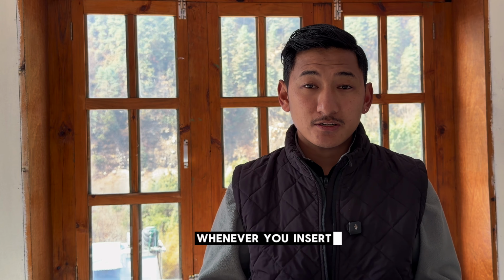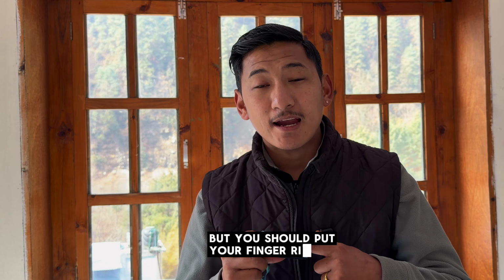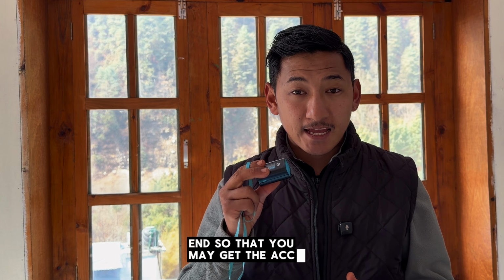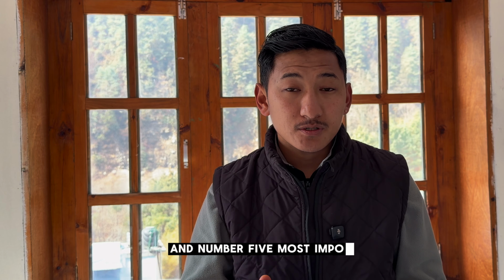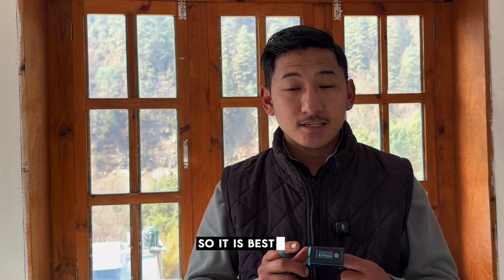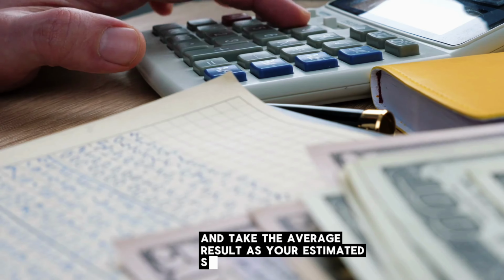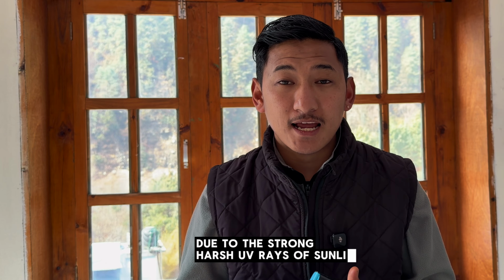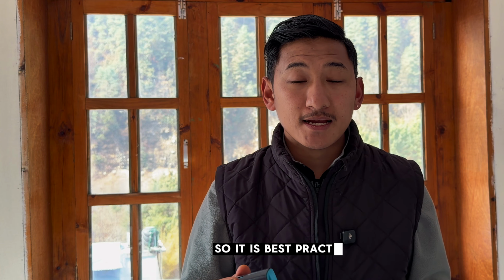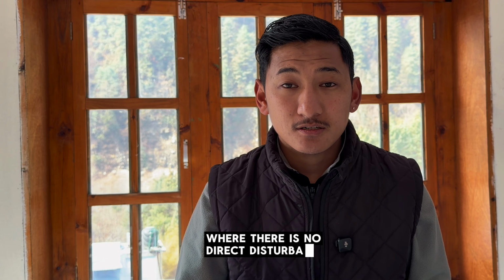Number four, whenever you insert your finger, not only at the top of the oximeter, but you should put your finger right into the oximeter end so that you may get an accurate result. And number five, most importantly, a single result from the device cannot be accurate, so it is best if you take multiple readings and take the average result as your estimated SpO₂ concentration in your body. And finally, if you take the result in direct sunlight, due to the strong harsh UV rays of sunlight, your result may not be accurate. So it is best practice to take the readings inside a room or dining area where there is no direct disturbance of heavy lights.